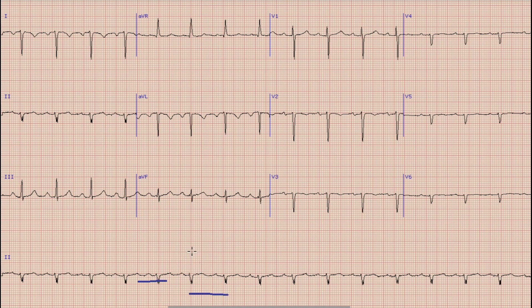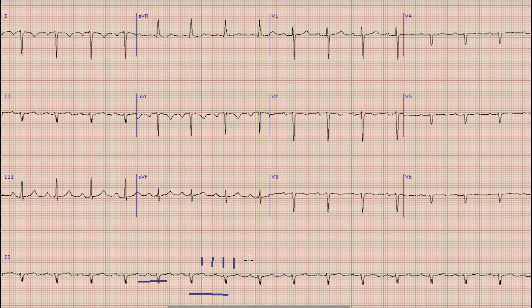The next thing is heart rate. We select a QRS complex which lies on the broad line, and from that QRS complex to the next QRS complex, we count the boxes as 300, 150, 100, and 75. The second QRS lies between 100 and 75, so the heart rate is likely around 80 to 85.